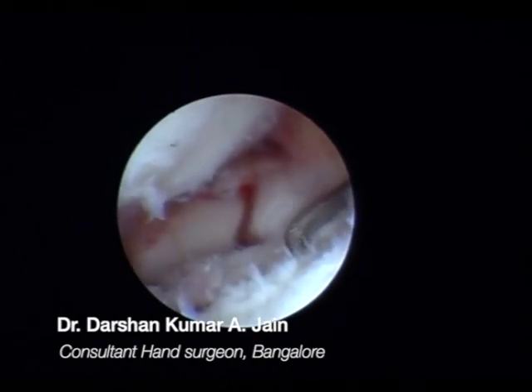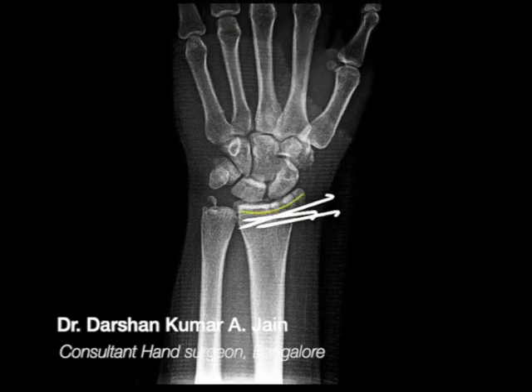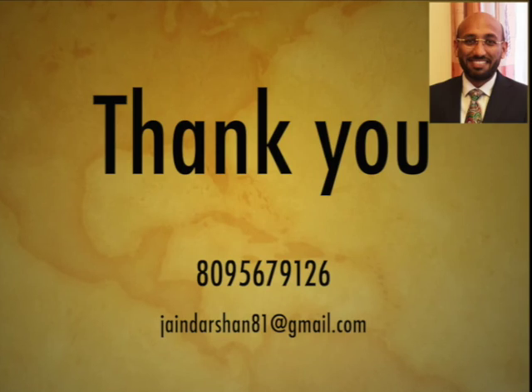As you can see, these fragments are too tiny to be held with screws. This was stabilized with a K-wire, and you see a nice, well-reduced distal articular surface. This can be supplemented with volar locking plate fixation as well. Thank you.